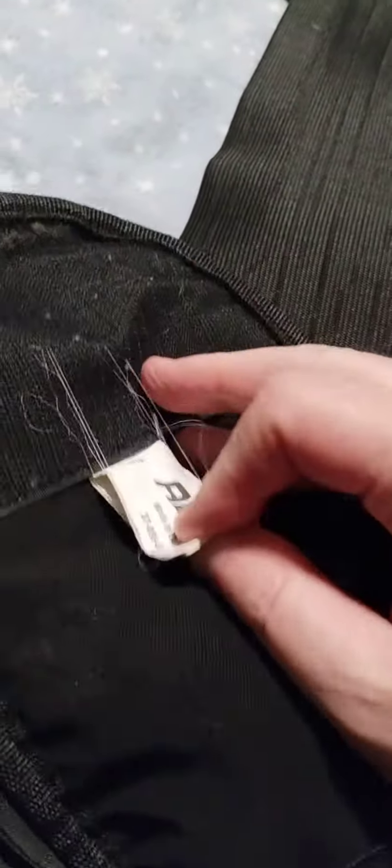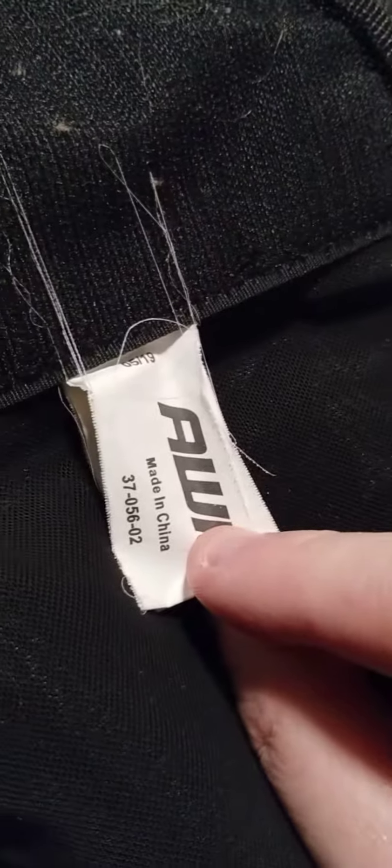I needed to get a new one because it's literally ripping in half all down where you pull on the Velcro, and it's almost a little small. So I'm ordering a larger one on Amazon, and the one on Amazon has like a gel pad right here.